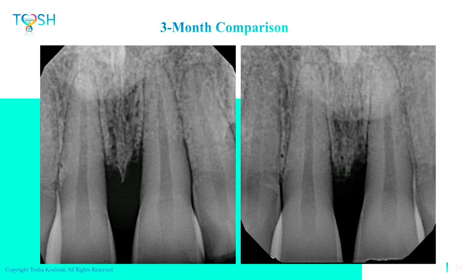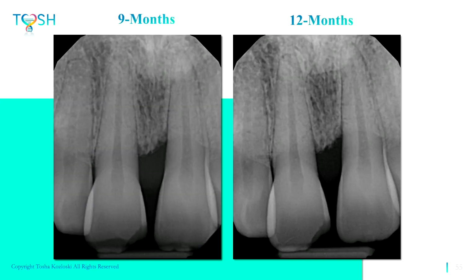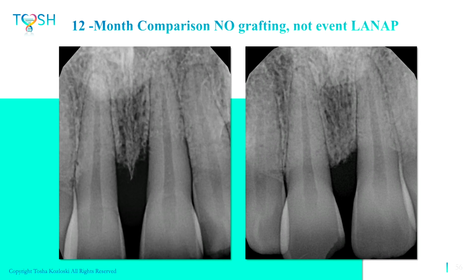The microscope looks good. Your lab test looks good. Your x-ray looks amazing. So we kept tracking her through time, 9 months, 12 months. And so at 12 months comparison, I mean, no grafting. I didn't have a laser in this office. It was antimicrobials, full mouth Cavitron, full mouth every single time that she came in. And she was diligent with her home care.